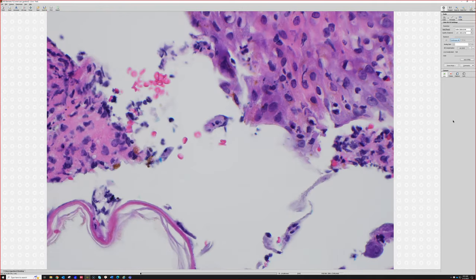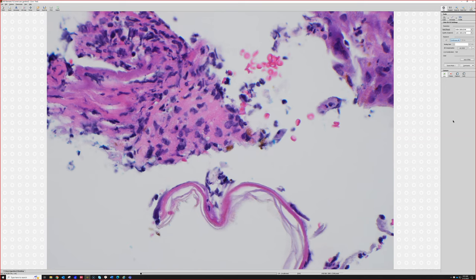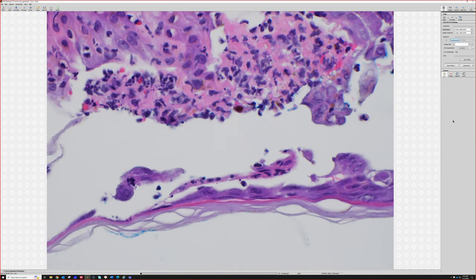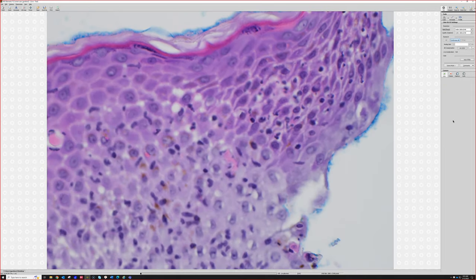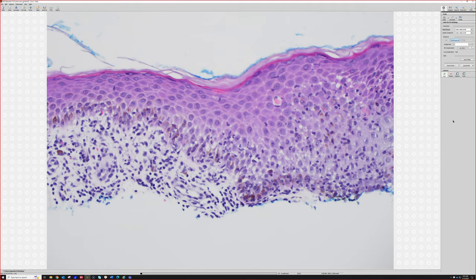And what you might have is an ulcer with dirty necrosis and neutrophils in the base. And you may not see a blister. Other times you'll have a blister with acantholysis, detached floating keratinocytes, but you won't see good herpes change. Sometimes you won't even see the blister and you'll just see the skin next door to the blister, which often has kind of a lichenoid inflammatory response with dying keratinocytes. I've seen one that originally I thought was going to be a lichenoid dermatitis, and then I cut deeper and there was a herpes blister.